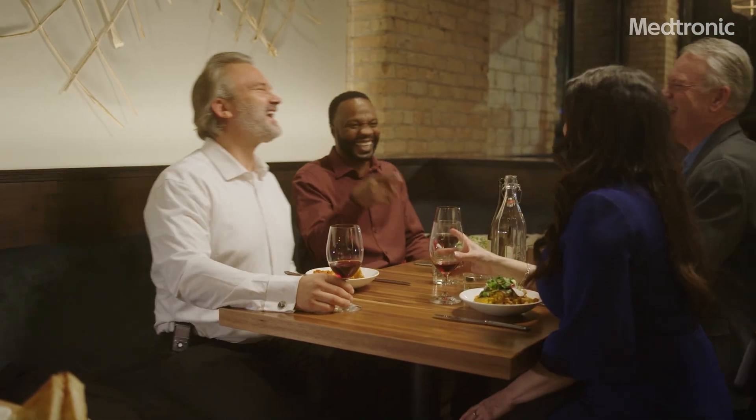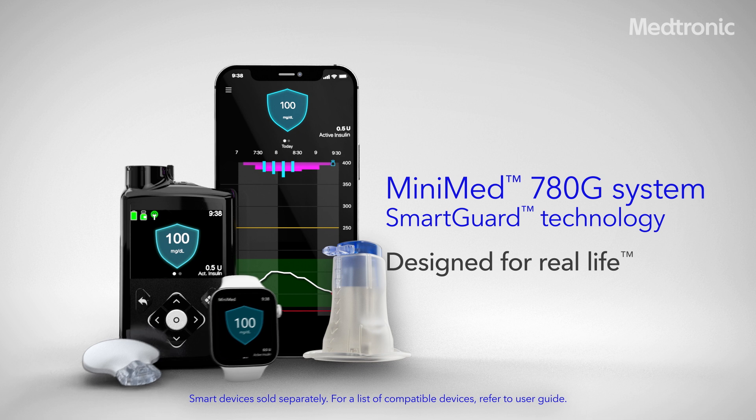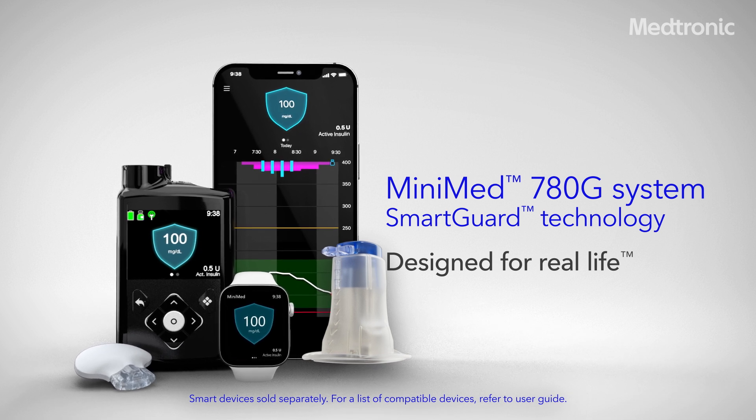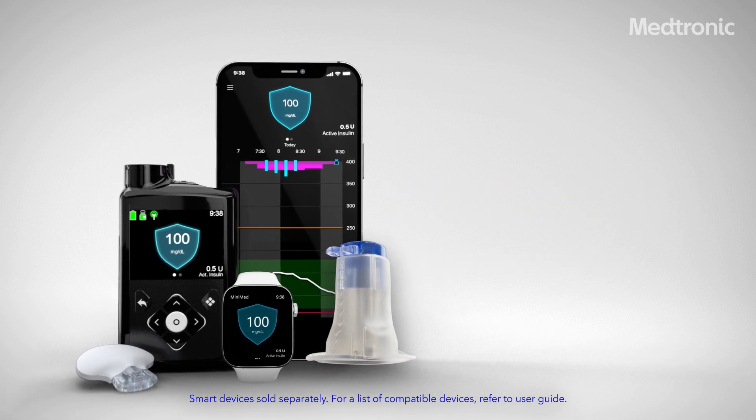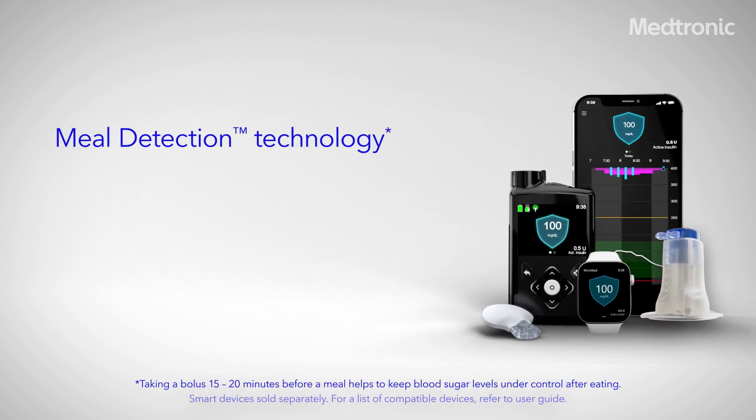This is the MiniMed 780G system, designed for you and the way you live your life. Let's face it, we all might miscount carbs or miss a meal dose. That's why we're excited to bring you the only system with meal detection technology.